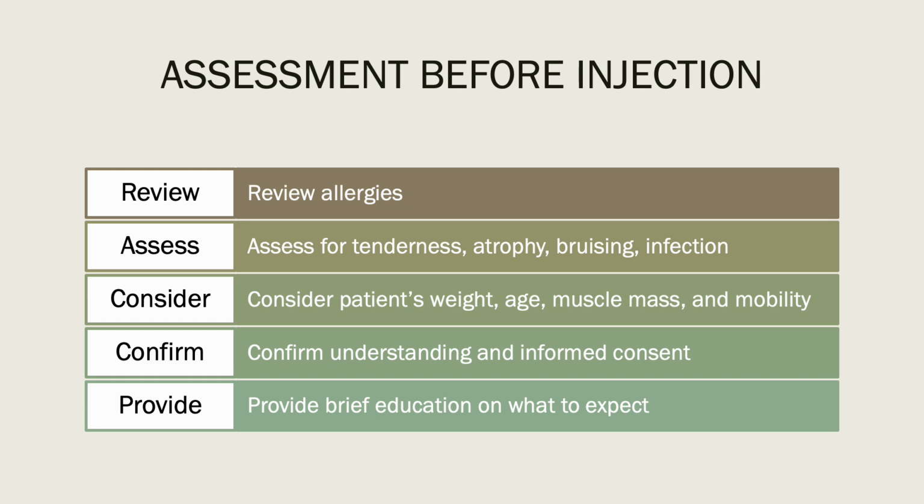So first and foremost, we must assess our patients and the environment. We want to check for allergies, both medication related and latex related. Then we evaluate the proposed injection site. Is there any tenderness, swelling, bruising, or infection present? We want to avoid any site that shows signs of damage or inflammation.